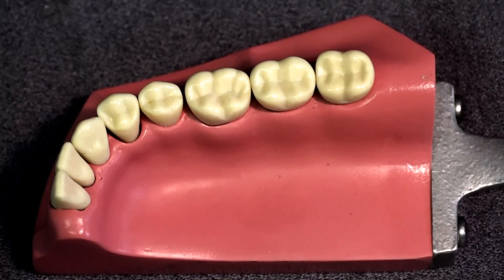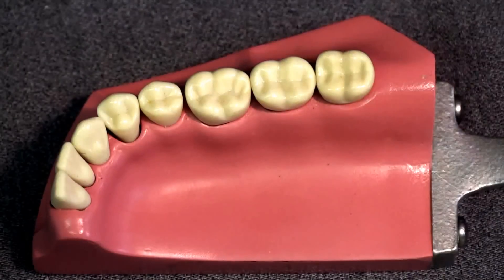I'm going to demonstrate the use of a sectional matrix and a clear custom matrix technique to save five to ten minutes on your next composite while improving the quality and doing this more easily.